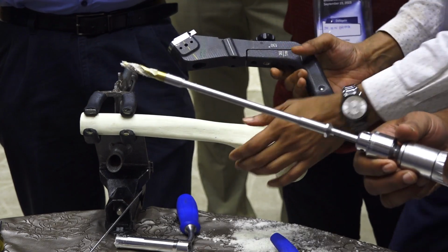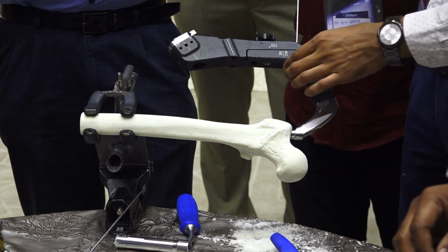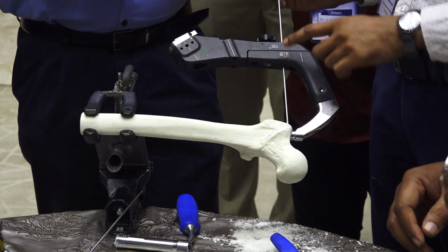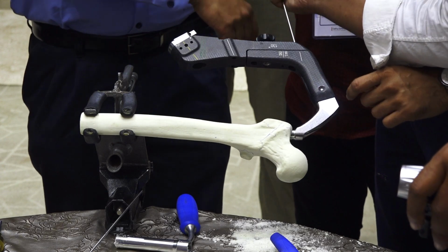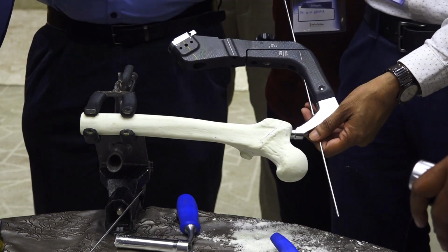Here is the end point. This is the nail end point. You can check in the C-arm where the tip of the nail is lying. This one is for anterior, in the lateral view, dead lateral view.